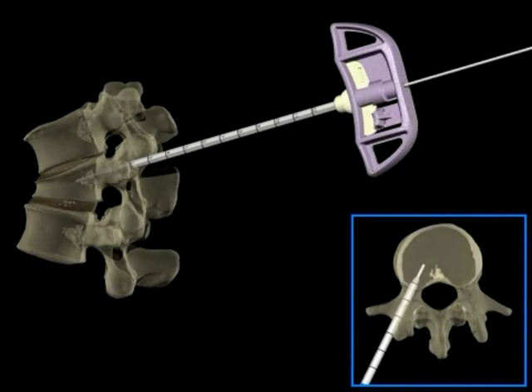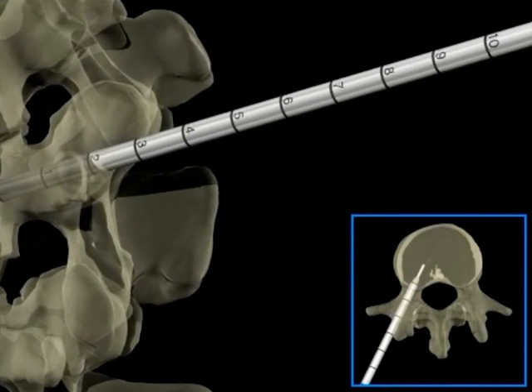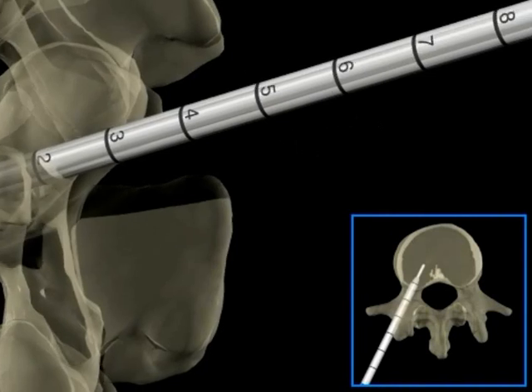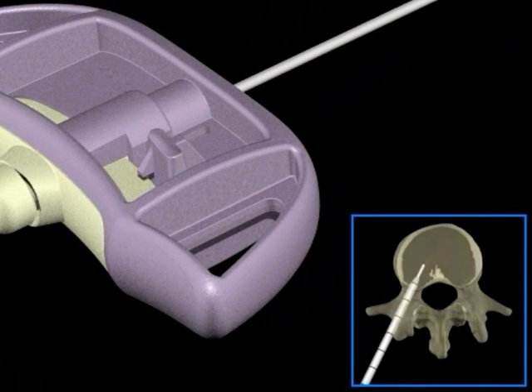Depending on the bone quality, a surgical mallet may be used to tap the osteointroducer handle during insertion into the bone. To maintain structural integrity, do not advance the cannula without the osteointroducer handle inserted. The cannula has 1 centimeter markings, which may be used as a reference of tool depth. These markings are not intended to replace the use of fluoroscopic observation. Remove the purple osteointroducer handle and guide pin from the working cannula. To remove the purple handle from the cannula, press in the release tab.